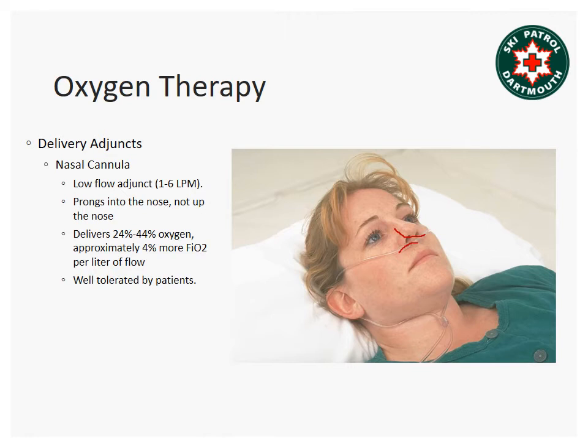These are generally well tolerated by patients, preferable to a mask in that they don't cover the face and cause that sensation of claustrophobia. And this is properly applied around the ears, under the neck, and cinched up but not so tight that you pinch the patient.